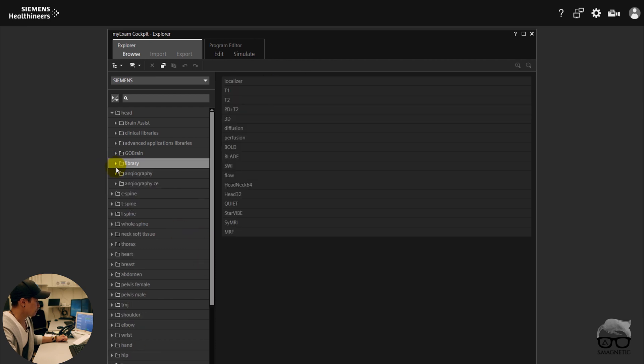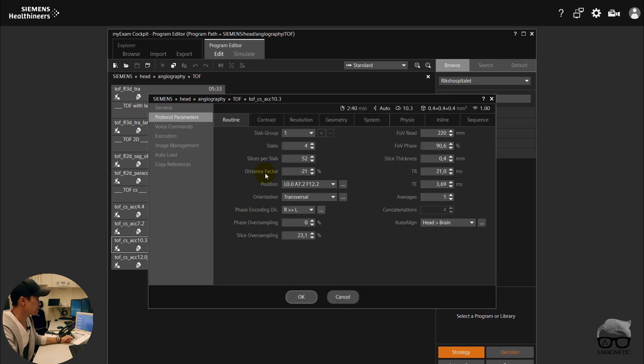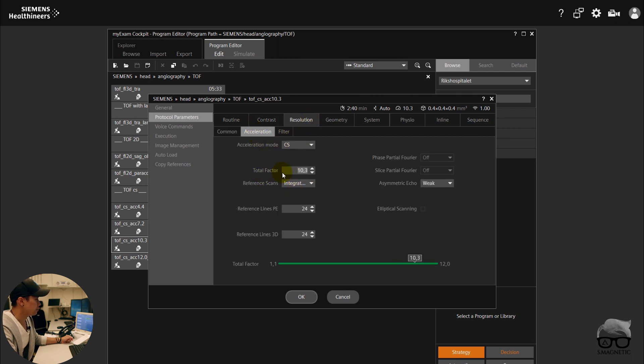There is also Compressed Sensing — let's check that. For example on a TOF sequence, you have different Compressed Sensing presets here. If you have a very high Compressed Sensing setting, the scan time will of course be shorter. Compressed Sensing is right here under Acceleration — you have the factor, the total factor you can control. Let's say set it to five, and then you see the scan time adjust. You need to work on this, optimize it, and see what's good for you.